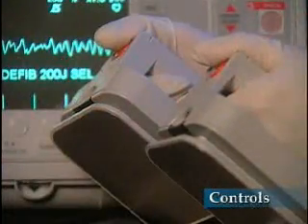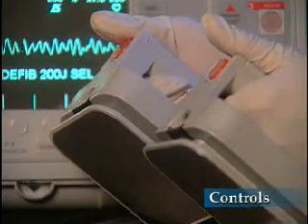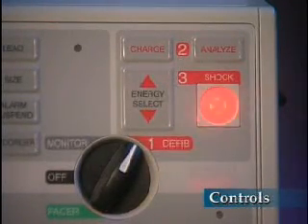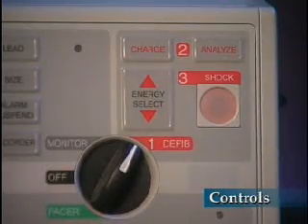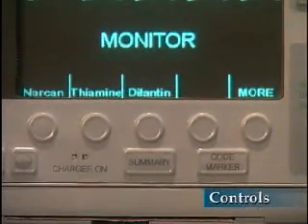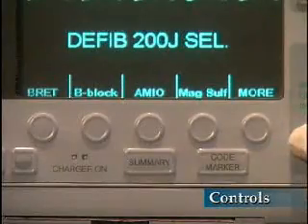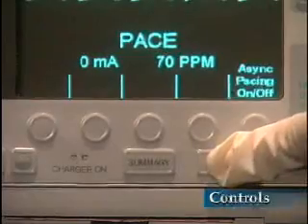Each paddle has a shock button. You must press and hold both buttons simultaneously to discharge the defibrillator when using paddles. The front panel also has a shock button that lights up when the defibrillator is charged and ready. Press this button to discharge the defibrillator when using multifunction electrode, or MFE, pads. The five soft keys are used for code marker and other functions depending on the operating mode of the device. Labels for the soft keys appear at the bottom of the display directly above each key to indicate its function when these features are used.